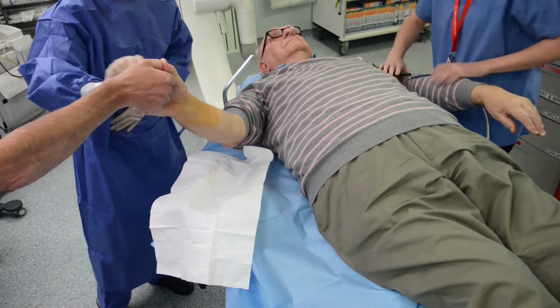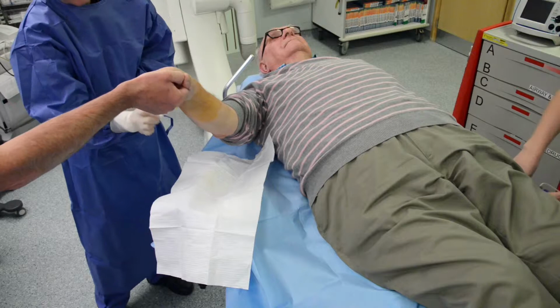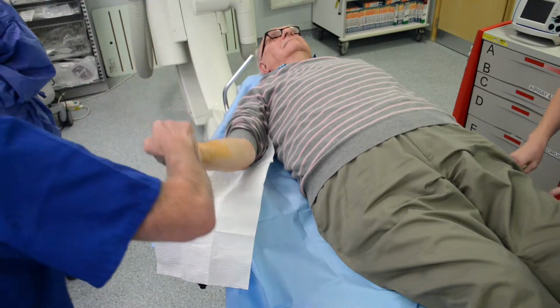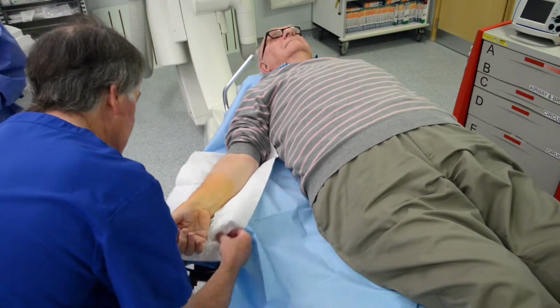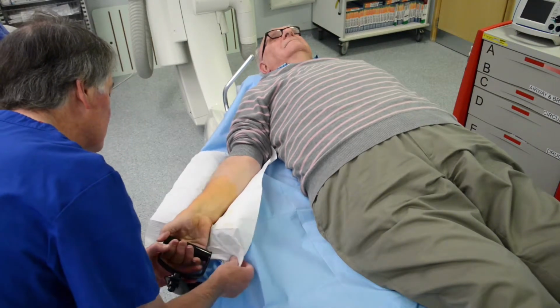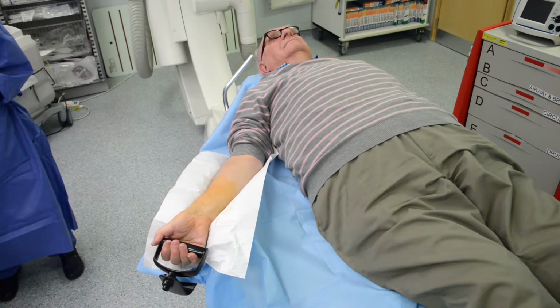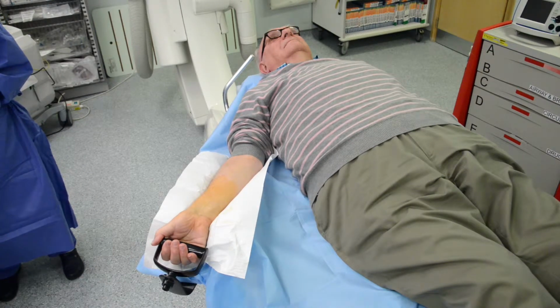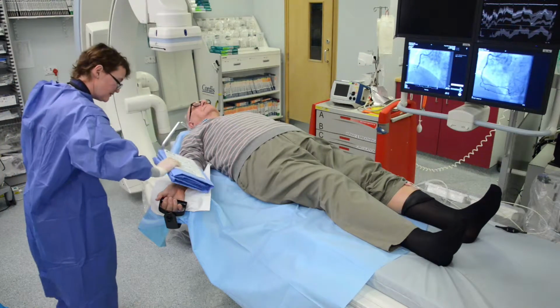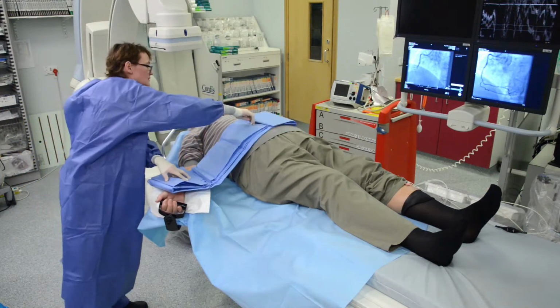We tend to complete more angiograms from the artery in the wrist, to aid recovery time and convenience for the patient. However, we may use the groin if the pulse in the wrist is weak, if there is a previous history of coronary artery bypass grafts, or if you have bendy or wriggly arteries in your arm. You will be draped with a sterile sheet to reduce the risk of infection.